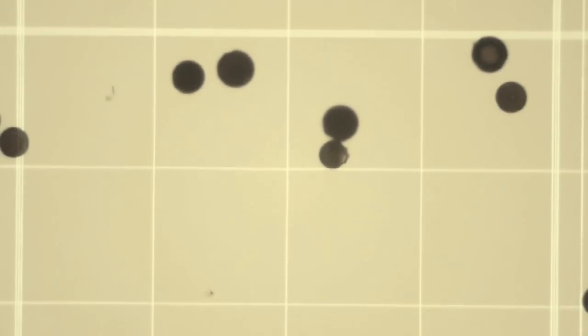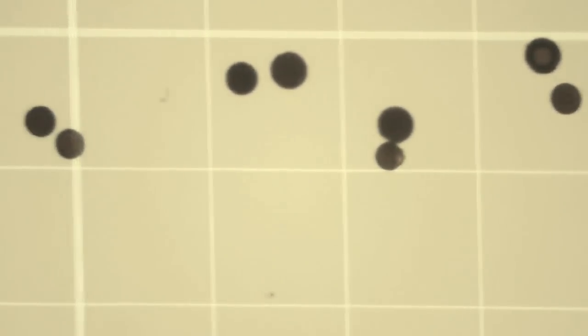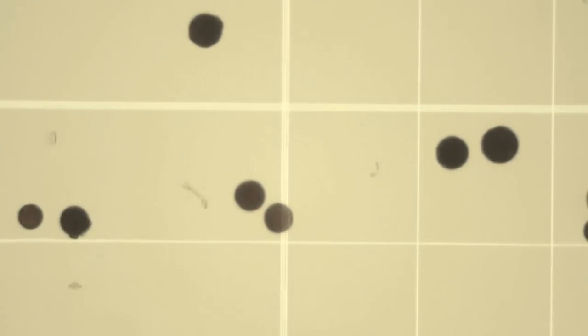Okay, so here's the top chamber. Now, let's look quickly at these two that are in the center. I won't count either of those. One of them is outside the chamber entirely. One of them is mostly outside the chamber. Different laboratories have different protocols, and you should follow, of course, whatever your laboratory director says. But in that particular case, we don't count things unless they're mostly in, and that one is mostly out.